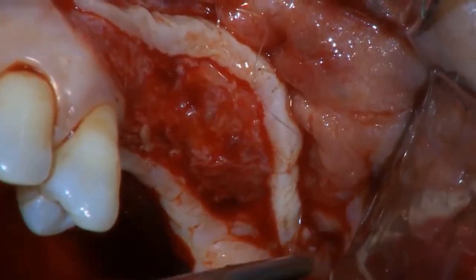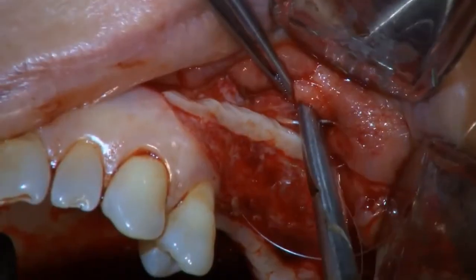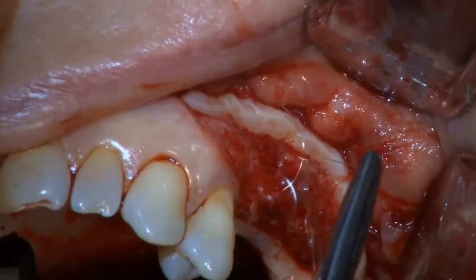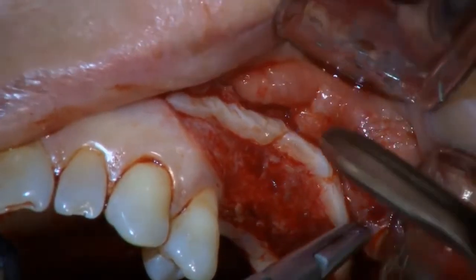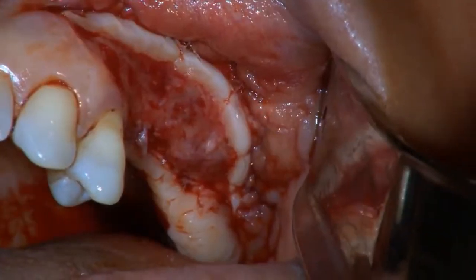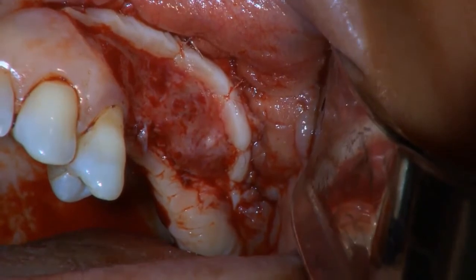First on the distal end, then cross-mattress sutures are placed to fix and position the length of the strip, and a single suture is used to attach the mesial end of the graft. Here we see the strip graft fixed in its desired position.